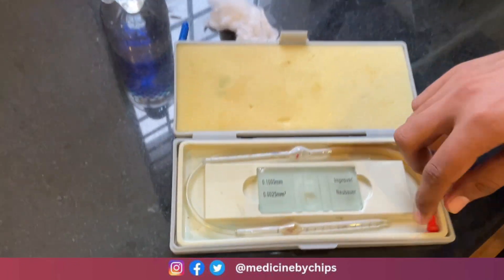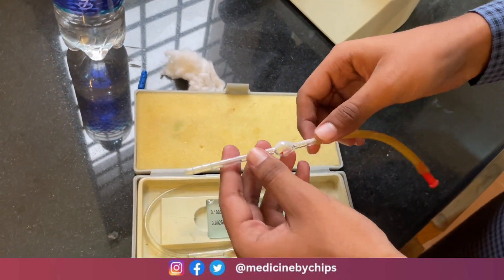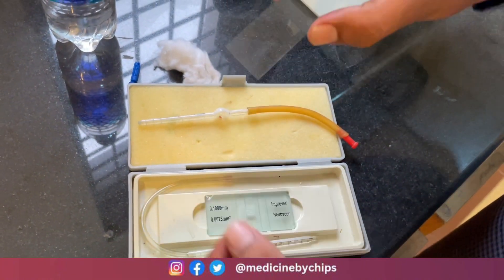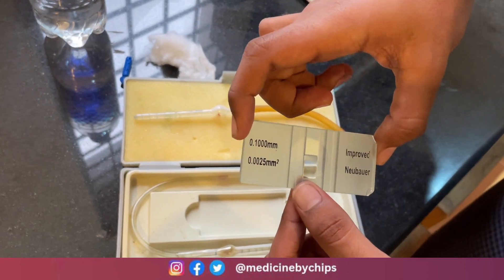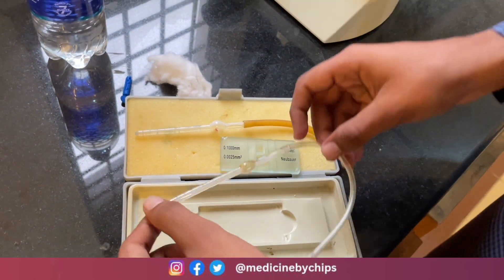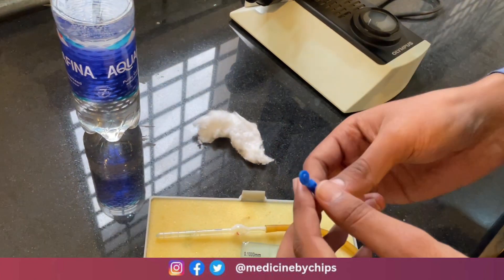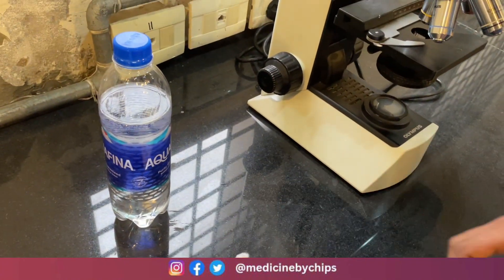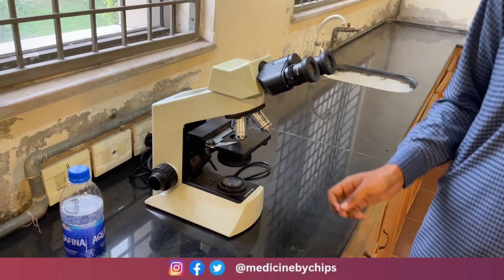First, we have the RBC pipette, which is used to suck the blood and mix the contents. There is a coverslip, and there is a Neubauer chamber which is used to count the RBCs. There is another tube known as the WBC pipette. In this procedure we also need blood, so we have a pricking needle and cotton gauze. We will count the RBCs using a compound microscope.